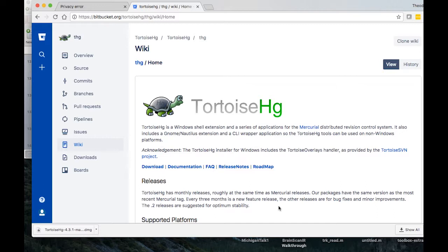And so if you want the latest, greatest version, because as I'm working through the example today I found a mistake that I fixed right here in front of you, I can push those changes to the internet, and you can check out the latest version on your computer. And if you don't like those changes, you can roll back to the version from February 2016 or whatever to keep a nice stable version for your study.